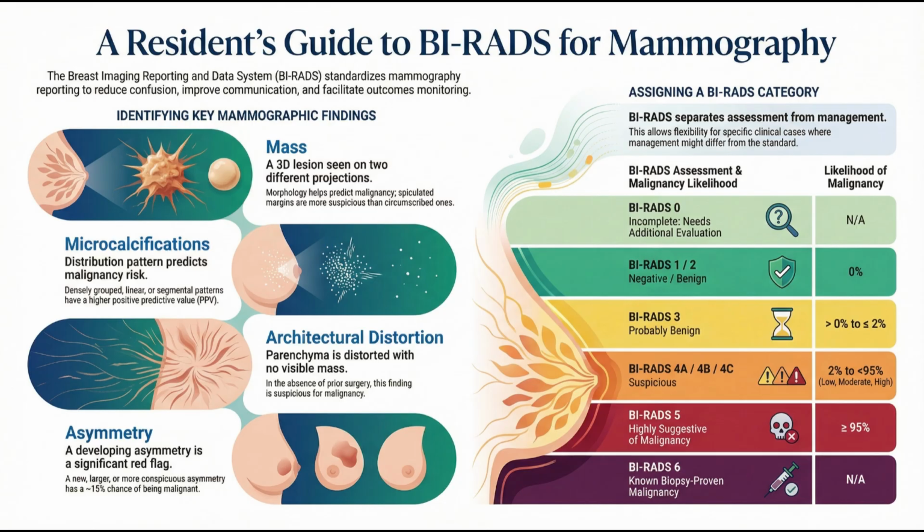So it's not just about a category. It's about reliable communication. Totally. It's what lets a center in New York compare data accurately with one in Singapore. The American College of Radiology, the ACR, and the Society of Breast Imaging are very firm on this. It's mandatory for training, right? They recommend mandatory use in all training. If you're learning breast imaging, you have to use this language. The whole system relies on it for communication and, maybe most importantly, for monitoring patient outcomes over time.